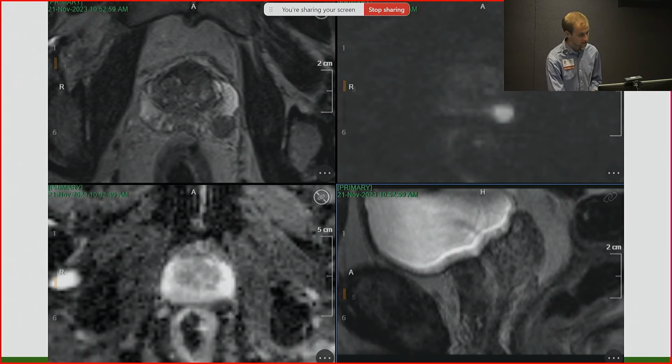So this is a guy, looking back at this, I questioned, well, did I really need to go through the whole rigmarole of doing a targeted biopsy on him? He had a suspicious nodule. He had an elevated PSA. I did detect that probably same cancer based on the systematic biopsies alone. So my knee-jerk reaction is, well, no, I didn't really need the MRI from a diagnostic standpoint.